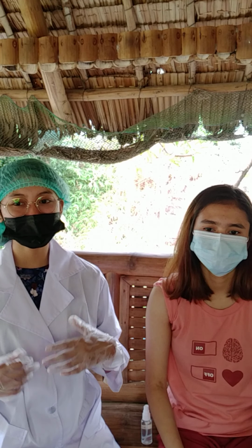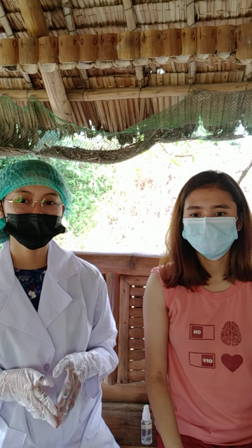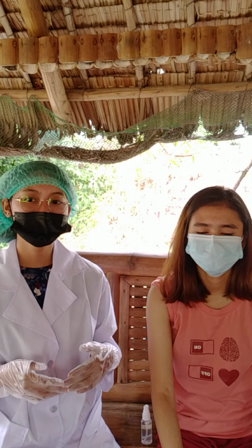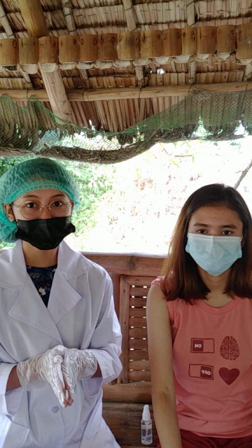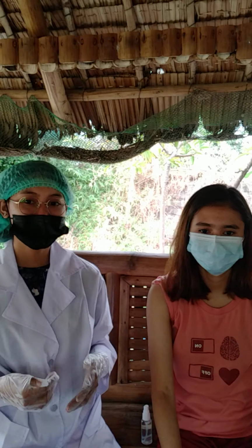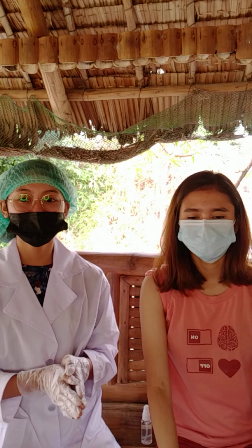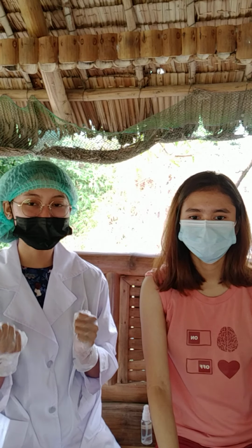So, and then after that, allow remaining air to escape quickly, and then repeat any suspicious reading, but wait for 1 minute. And then after that is when measurement is completed, remove the cuff, and natanggal na natin yung nakalagay dito sa brachial artery ng patient natin. And then remove the gloves na sinusuot natin, and then perform a hand hygiene.